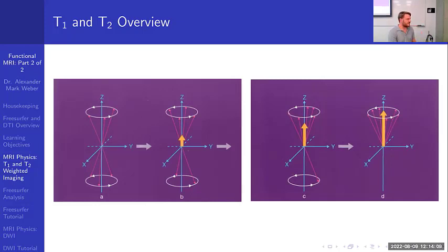They will use that to look for things like edema and white matter loss. But if you do want a technique that's more specific for myelin, you might use something like myelin water imaging.